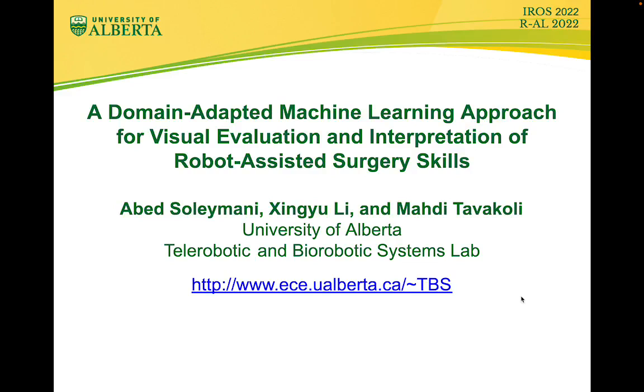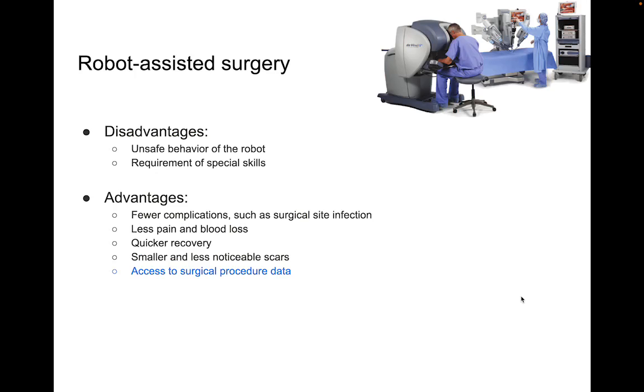I want to present my work, a domain-adapted machine learning approach for visual evaluation and interpretation of robot-assisted surgery skills. Robot-assisted surgery is becoming more popular in modern clinical practice. It has some disadvantages, such as unsafe behavior of the robot or requirement of special skills.